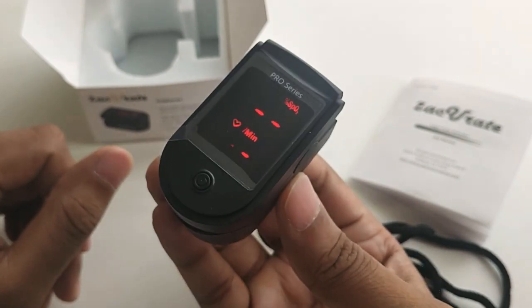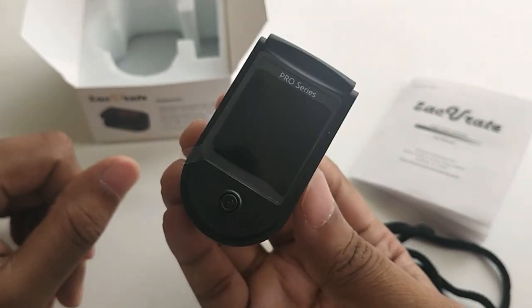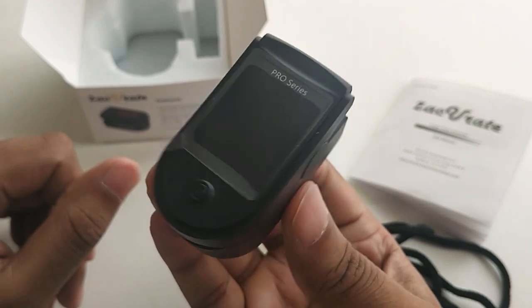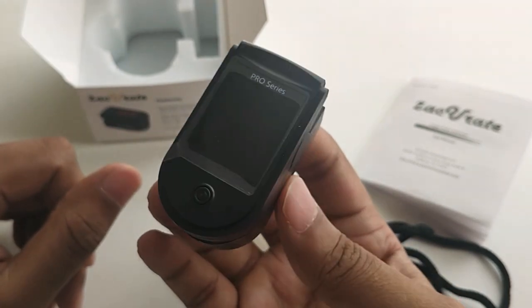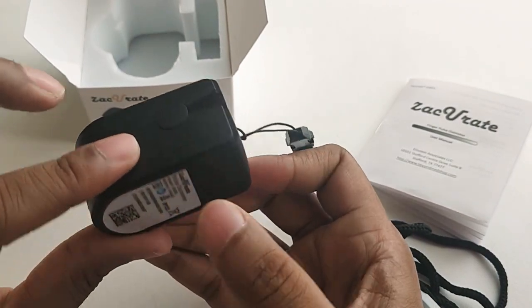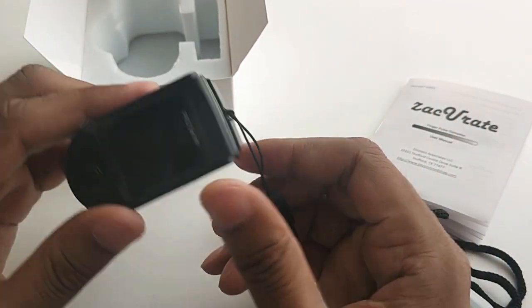This device is used in sports and medical checkups and you can keep it at your home. As you can see, it is now switched off. If you are not using it for a long time, you can remove the battery.